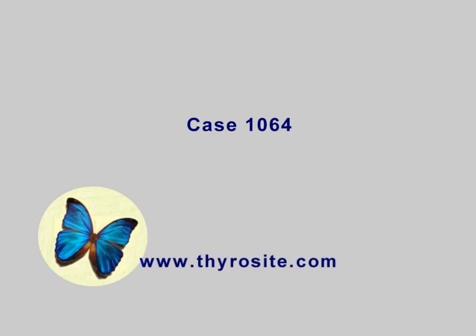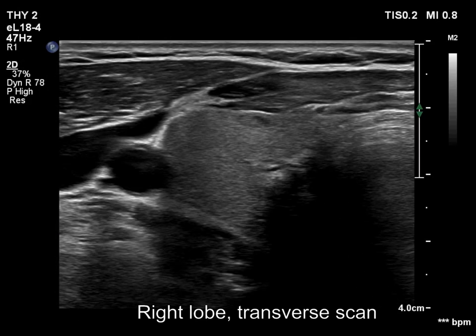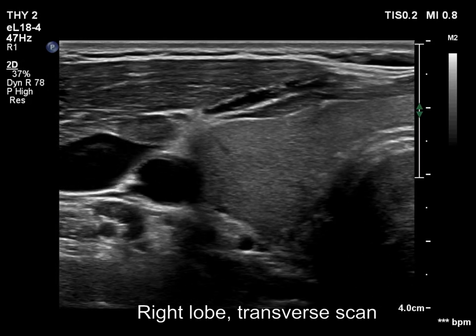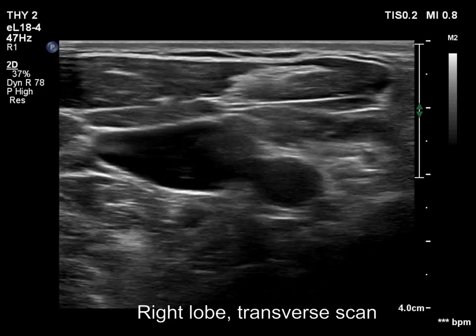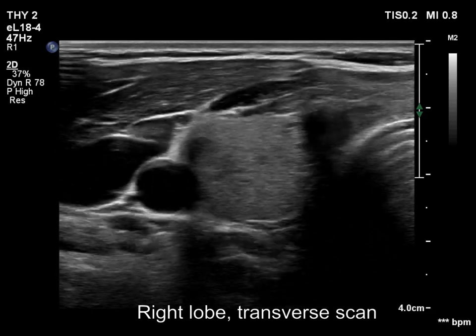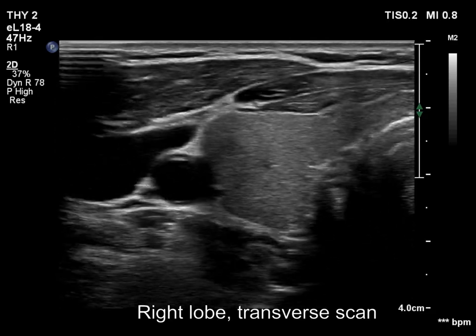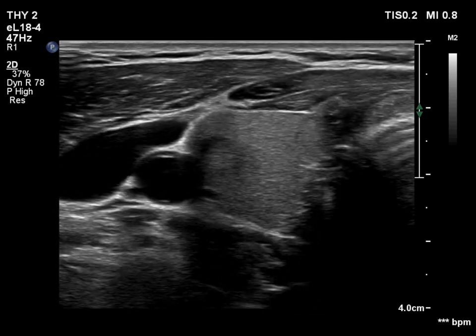The thyroid is isoechoic/normal. There are two discrete lesions in the right lobe. The medial one is interesting. Based on the acoustic shadow, the nodule must have coarse calcification.